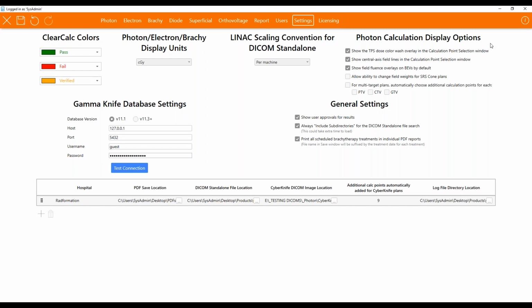And then the display options, we really have just gotten into letting you decide whether to activate or deactivate things from view. So the top two options were already there, but here we show the Fluence overlays. You can have it always be on.